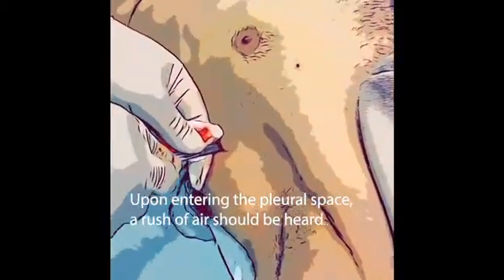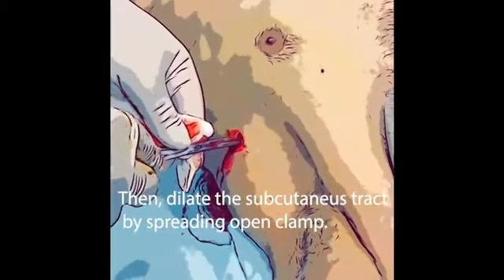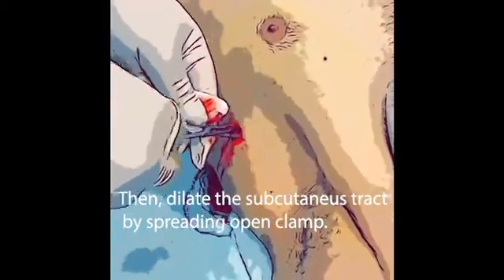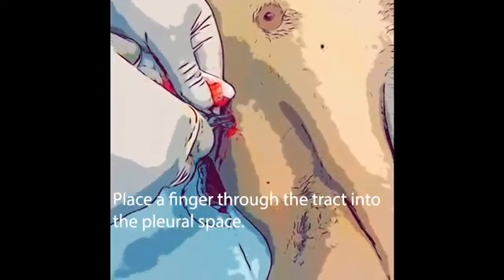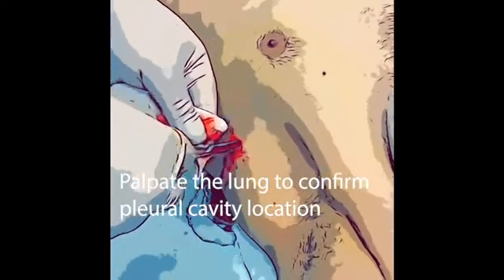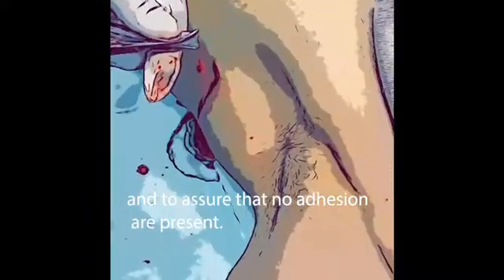Immediately above the superior edge of the sixth rib to avoid injury to the neurovascular bundle. Upon entering the pleural space, a rush of air should be heard. Then dilate the subcutaneous tract by spreading the open clamp. Place a finger through the tract into the pleural space and palpate the lung to confirm pleural cavity location and to assure that no adhesions are present.